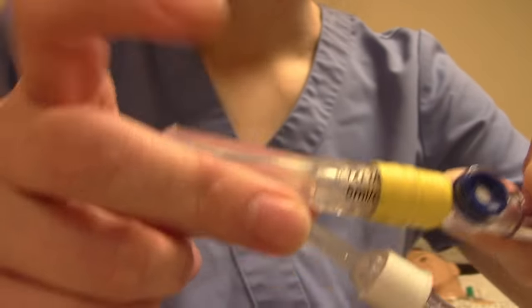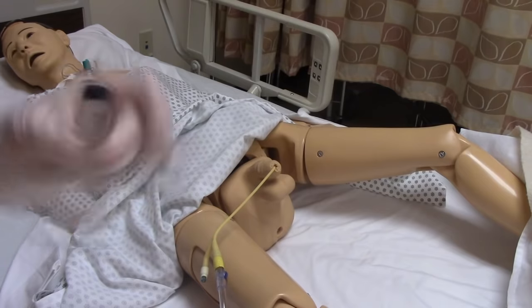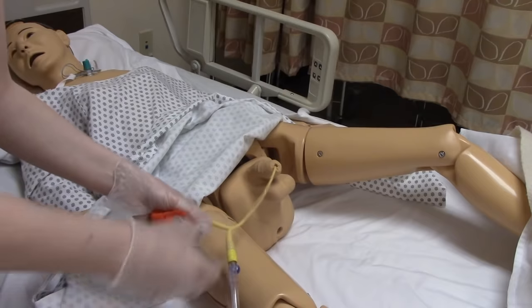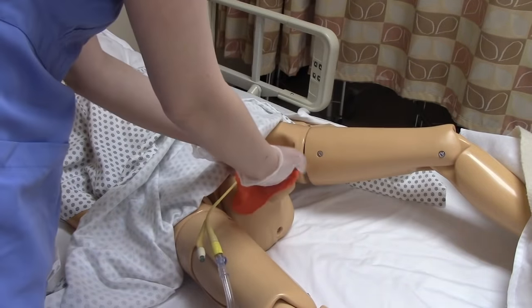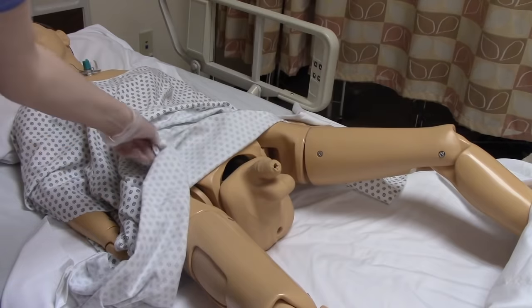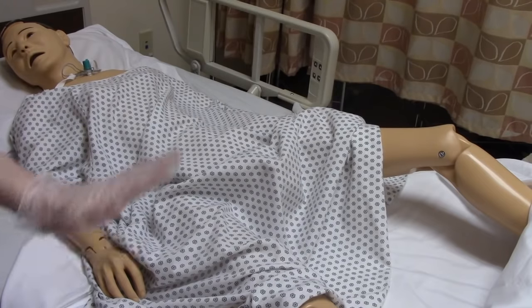When it's time to discontinue the catheter, it's actually much easier than insertion. You'll need two supplies: an empty syringe and a washcloth — and of course wear gloves. It should not hurt and takes only a couple of seconds. Attach the syringe and pull back to deflate the balloon, removing all the water. Tell the patient to take a quick breath, put the washcloth underneath, and on three — done, it's out. Dispose of the catheter and provide peri care. Let the patient know to use the call light for their first void so you can assess the color, consistency, odor, and amount.